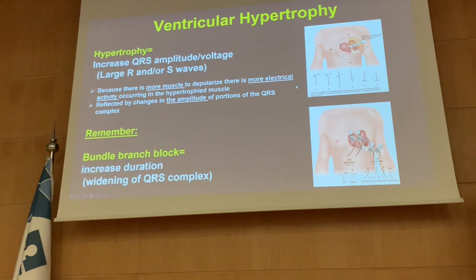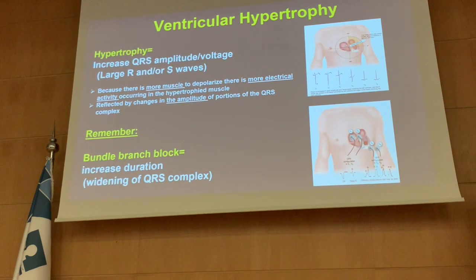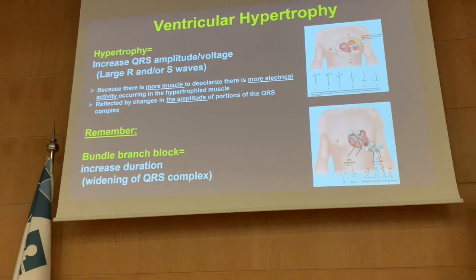As we said, if the ventricular wall gets hypertrophy, the wall itself gets bigger.